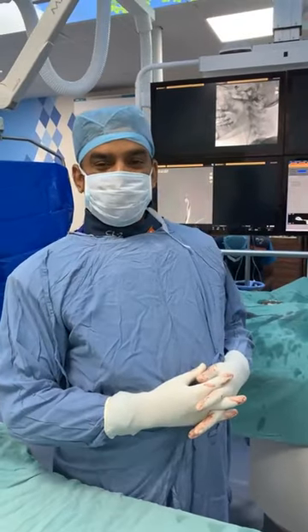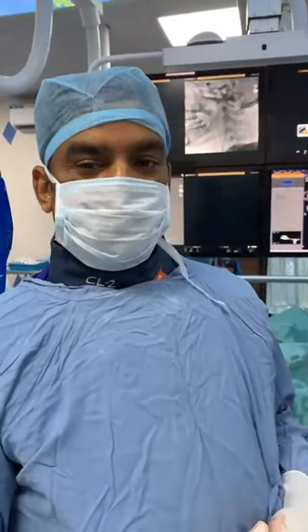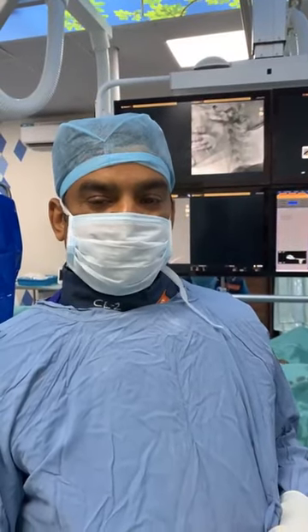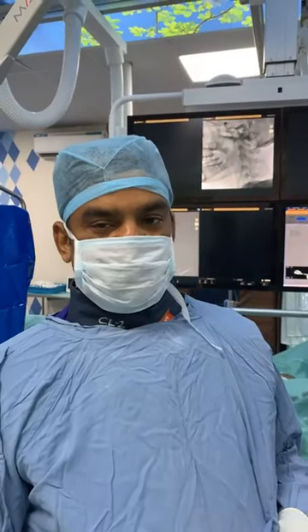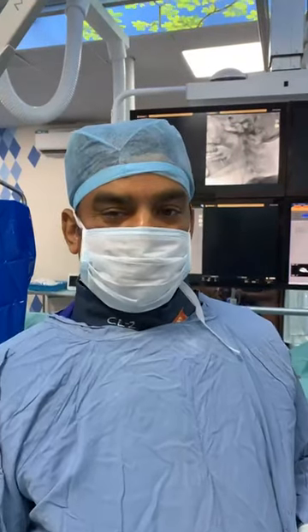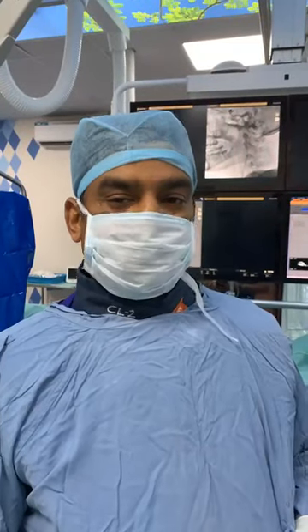So we have a young lady who has an aneurysm, and this aneurysm was treated with stent-assisted coiling 5 years back, and she did well with that. Then the lady again became symptomatic, so we did a check angio. We saw that the aneurysm has regrown, so we are going to place a flow diverter across that stent-assisted coil segment, covering the neck of the aneurysm.